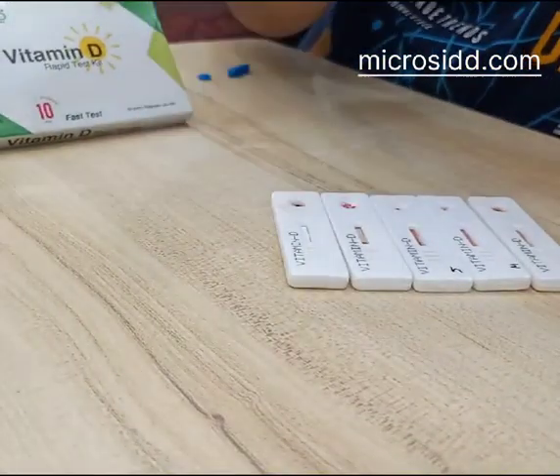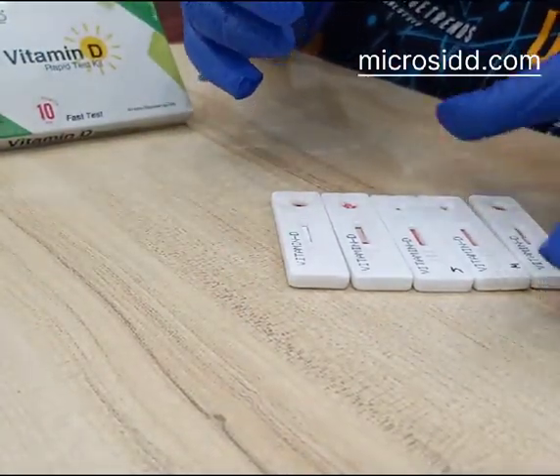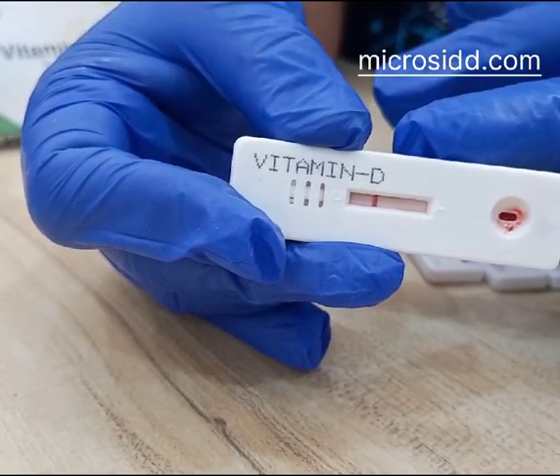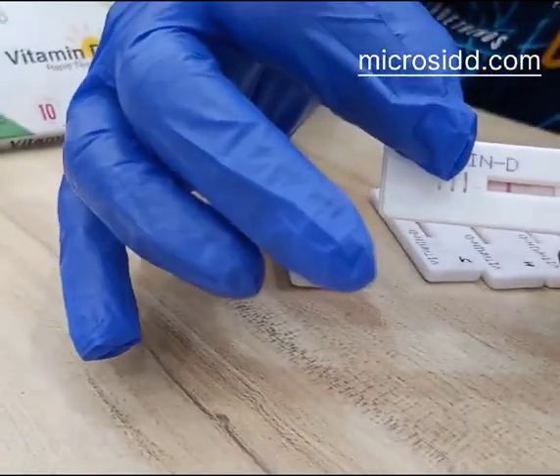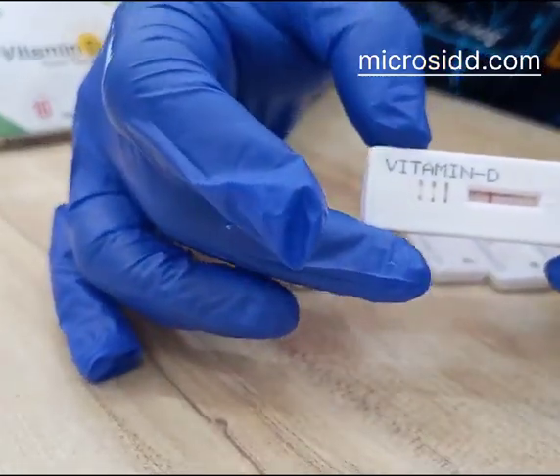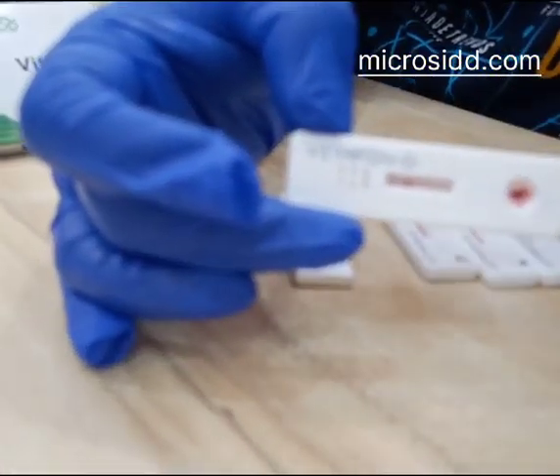Now we have done five samples with five different patients and five tests. This is one test showing sufficiency — Vitamin D in this patient is sufficient. The test has gone perfectly because the adequate and sufficient quantity of blood and buffer was used, timing was perfect, background is clear, and the test line is perfectly all right.